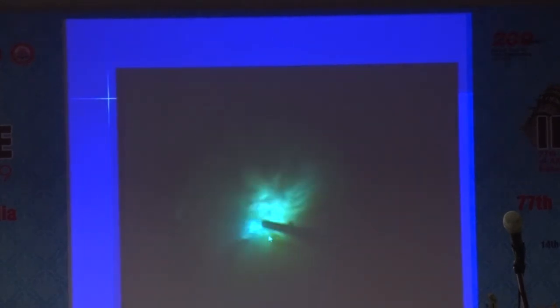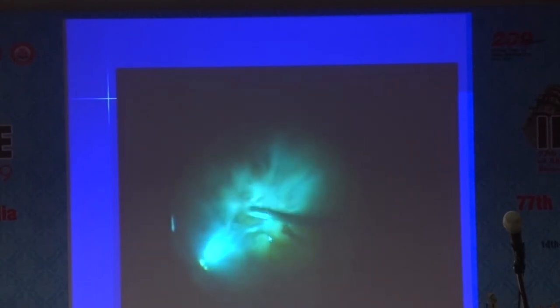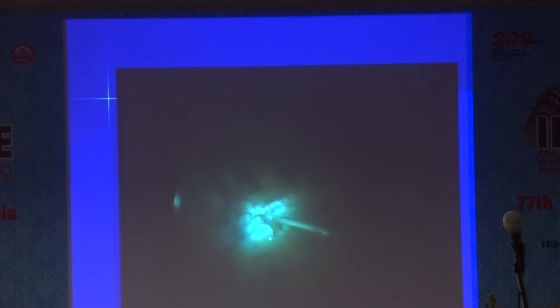So a severe PVR, this is the same case which I closed funnel. You see, the whole retina looks as if it is plastered. Now we have no choice here. This was a one-eyed child, the other eye was phthisical and blind for a long time. And you can see how long perhaps this retina must have been detached. The retina is in total folds. You can see it's just kind of puckered there. It was difficult. Now that's where you need that perfluorocarbon as a third hand.